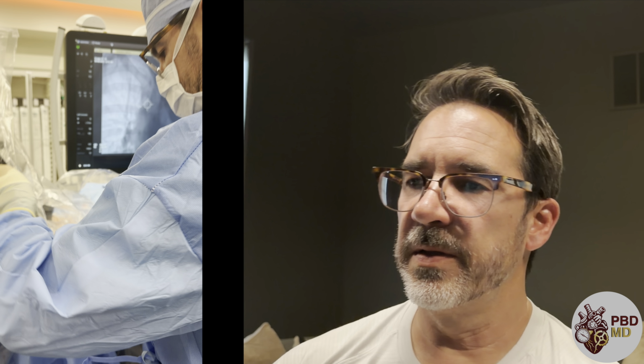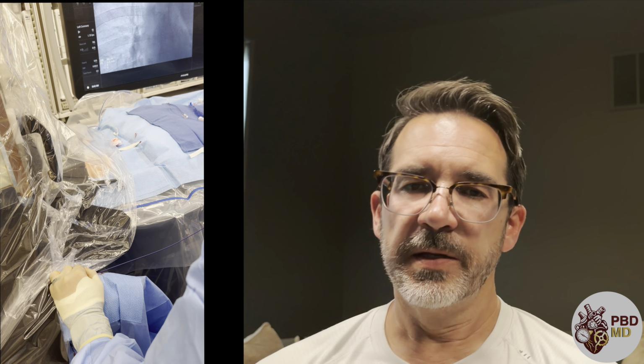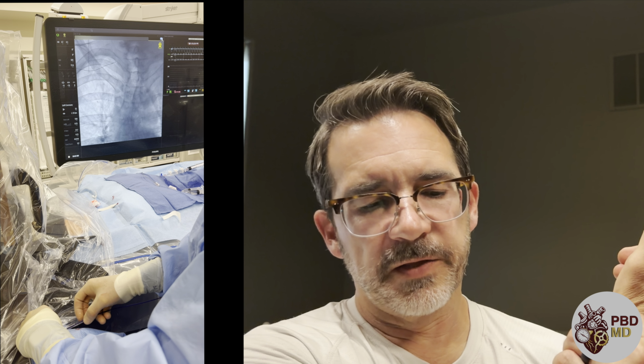So anyway, we get the lead around the person who's having the procedure, and then the next step is we're going to take first a wire and then a catheter. Catheter is over the wire, and we're going to run that basically up the arm. So typically we're using the right radial is where we're going to be getting access. Going to take the wire up past the elbow, past the shoulder, and then down into what's called the aortic arch. And the aortic arch kind of looks like a candy cane.